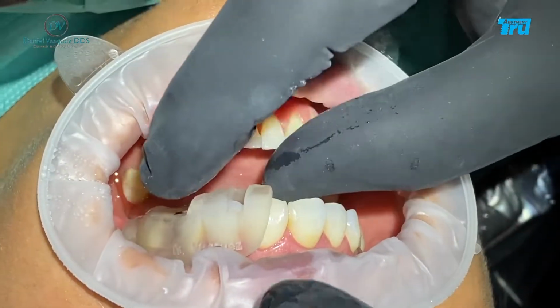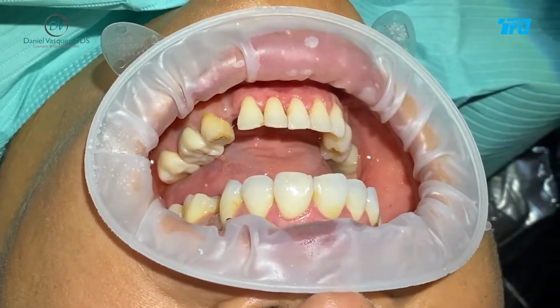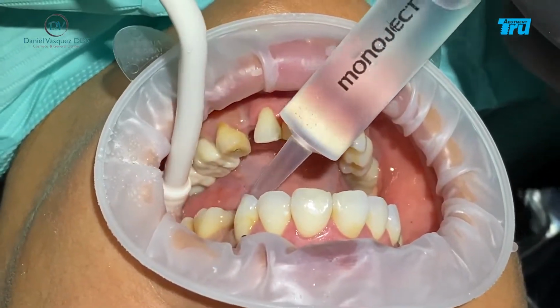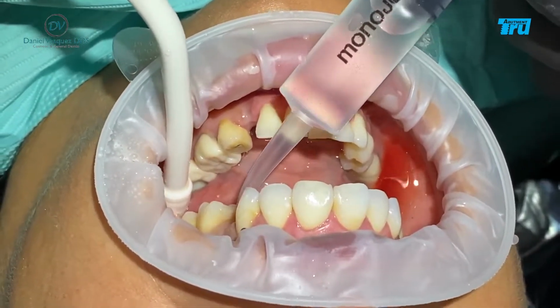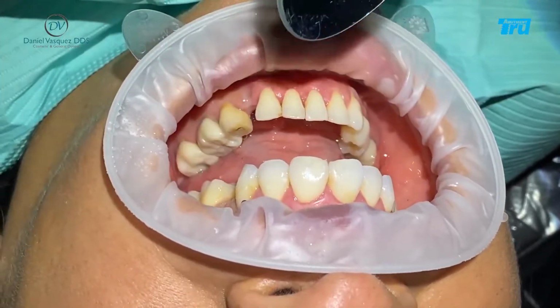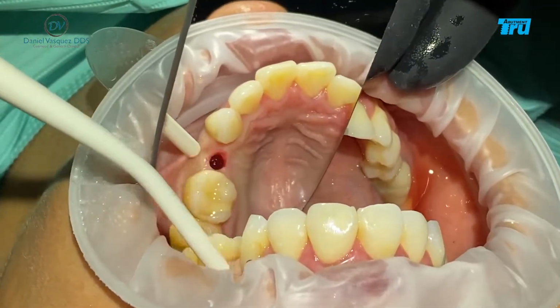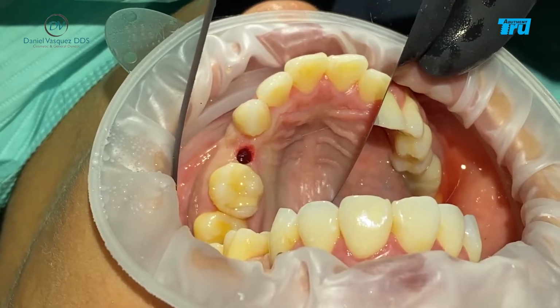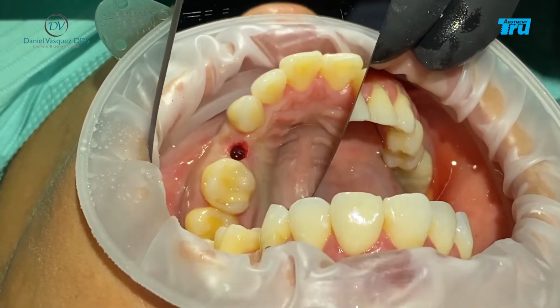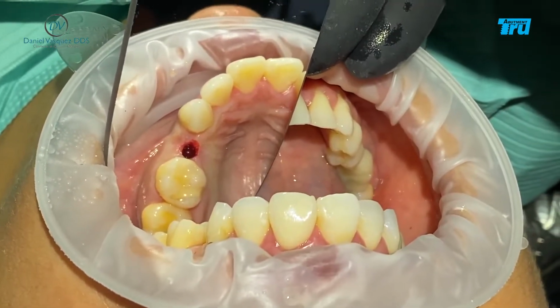So now, before we place the implant, I'm gonna remove this and we're going to rinse with sterile water. Make sure there's nothing left in there. Now, check how beautiful this looks. All right, the osteotomy is completely finished. There's absolutely no bleeding. Now we are going to be ready to place our implant.